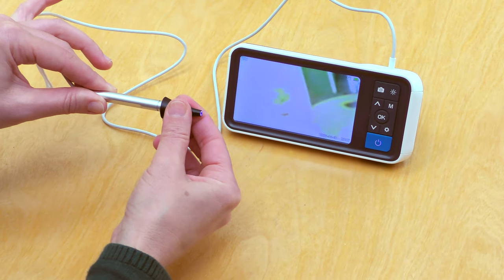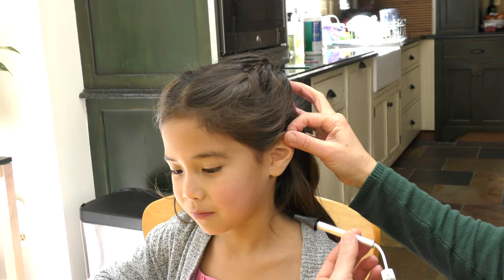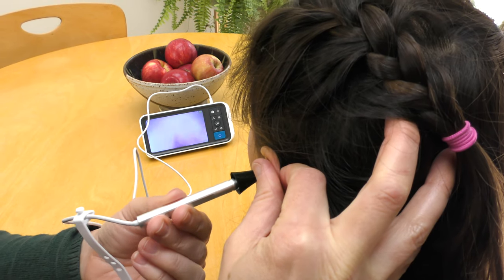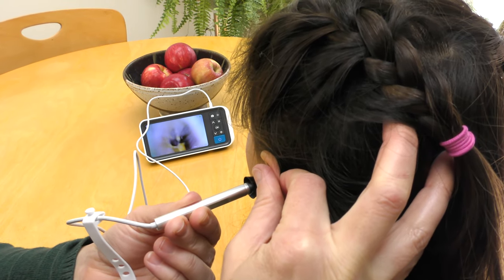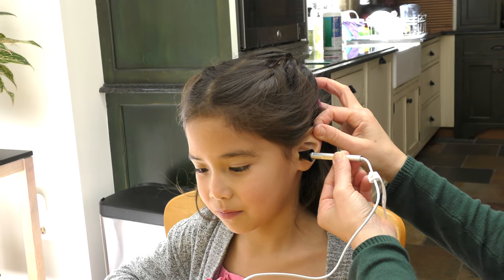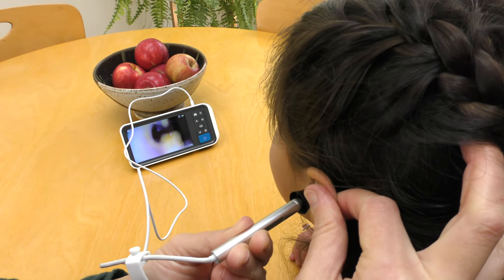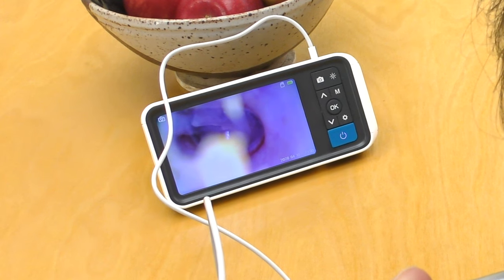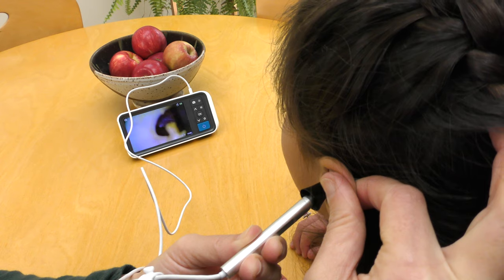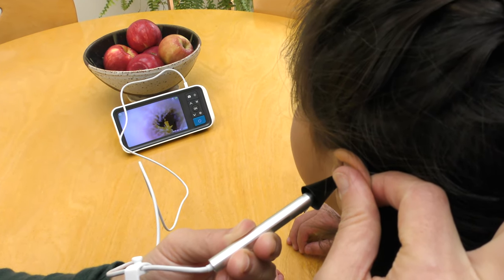Before use, attach the adapter. Gently pull the ear backwards to straighten the ear canal, then slowly and gently insert the camera into the ear canal. All movement should be slow and gentle. If the image is off-center, tilt the camera angle to re-center. As you can see, this child has earwax debris present in the ear canal, and in the distance you can also see the eardrum.